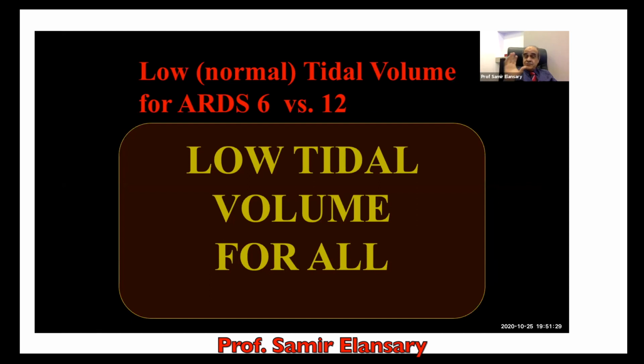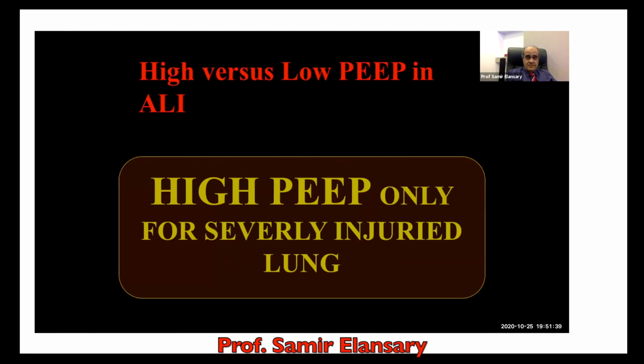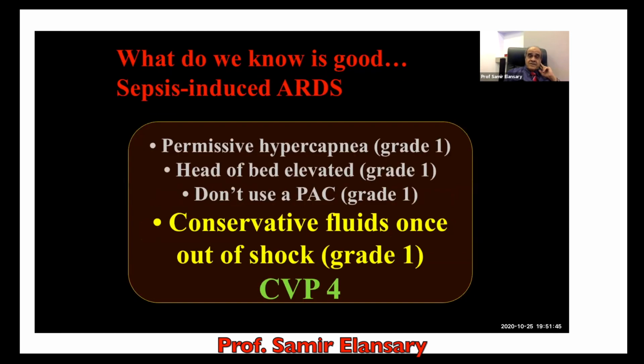Always attach yourself to low tidal volume for all patients, even an OR patient, in the operating room; it is better to use low tidal volume. High PEEP only for severe injury. Also, what do we know is good in sepsis-induced ARDS? This I want to stress again on some important points.